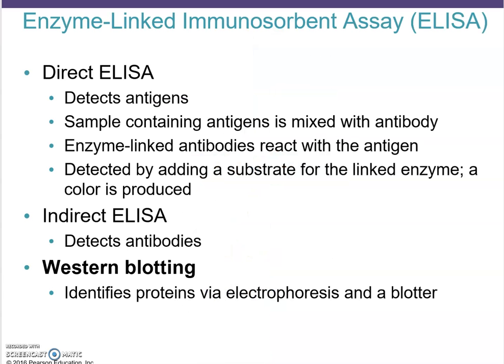Moving on to a very important technique that's called ELISA. So that's the abbreviation for enzyme-linked immunosorbent assay. There are two versions of that. You can either do a direct ELISA or an indirect ELISA, and you do have a lab that is assigned for this week, so be sure to do this. This is a very important technique.